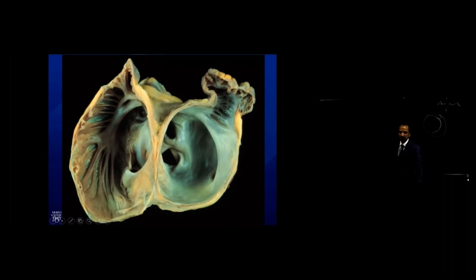If you can, solve the problem somewhere else. If not, look at imaging and see if you can see there's a major artery there. At the very least, don't ablate during flutter. So you're in sinus while ablating, maybe you'll be able to pick up that something's happening to the sinus node and you can stop ablating in that location.